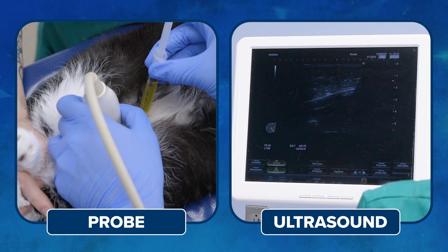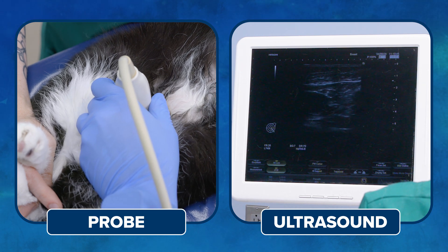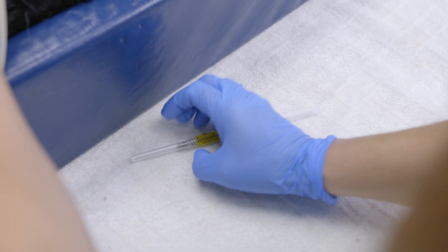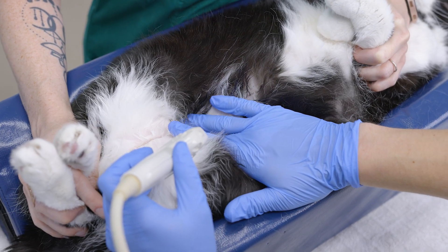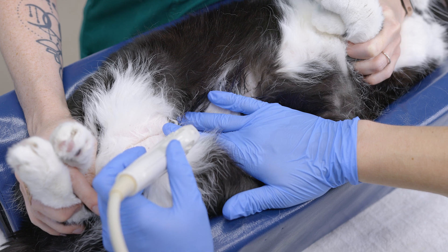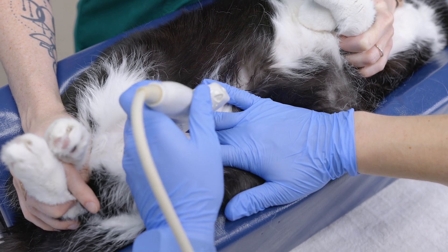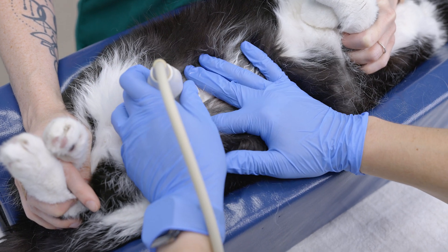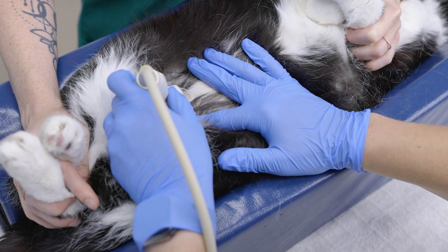Make sure your hand is off the plunger when removing your needle and apply some pressure. I'll use the probe until I can get my needle capped and then come back and put pressure on. You always want to check after a cystocentesis to make sure there's no free fluid around the bladder as a precaution. We'll check that bladder one more time — no free fluid is present.